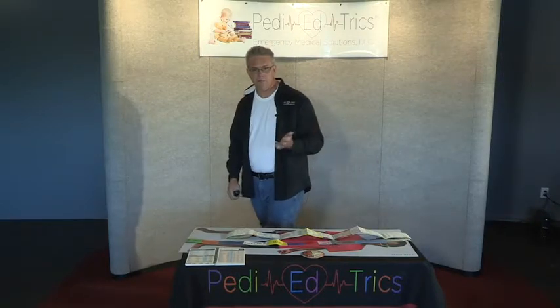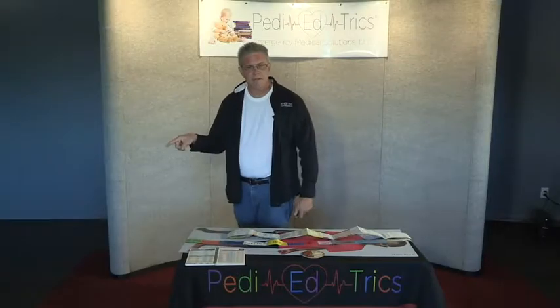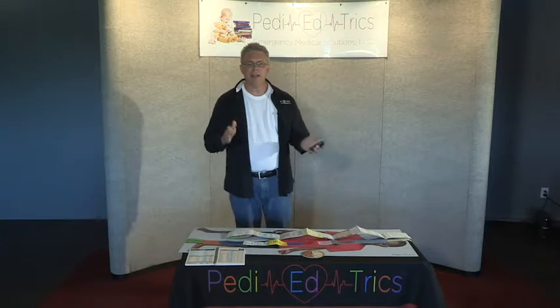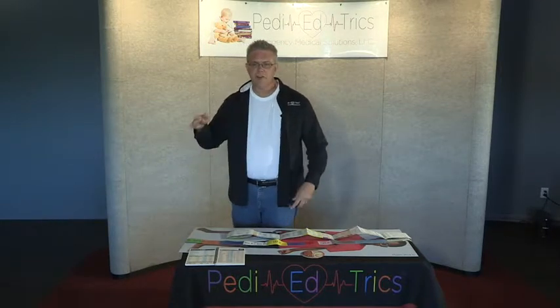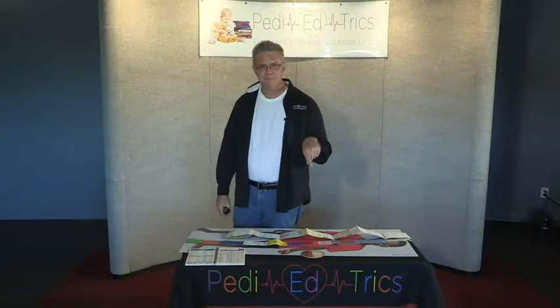So now we've got to suck out the boogers, so you're like, all right, we've got that whole 2 times 3 times rule. So 2 times is NG, suction, Foley. So if this child has a 5.5, right, quick bit of mental math, 5.5 times 2 is 11. The problem is, when you try to find an 11 French suction, an 11 French NG, or an 11 French Foley, they don't make them.